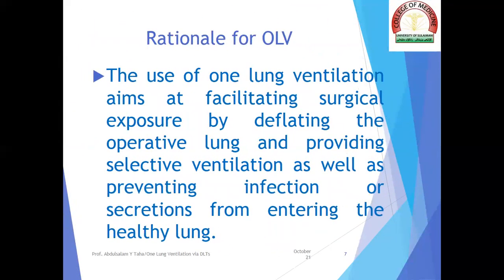Rationale for one lung ventilation. The use of one lung ventilation aims at facilitating surgical exposure by deflating the operative lung and providing selective ventilation, as well as preventing infection or secretions from entering the healthy lung.